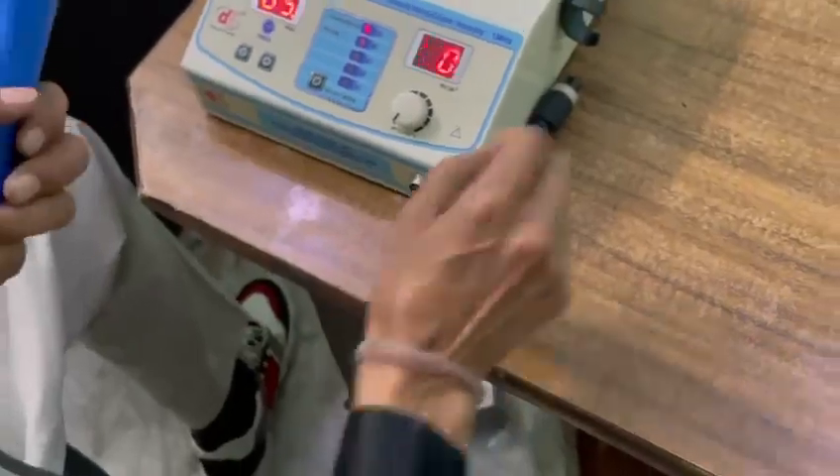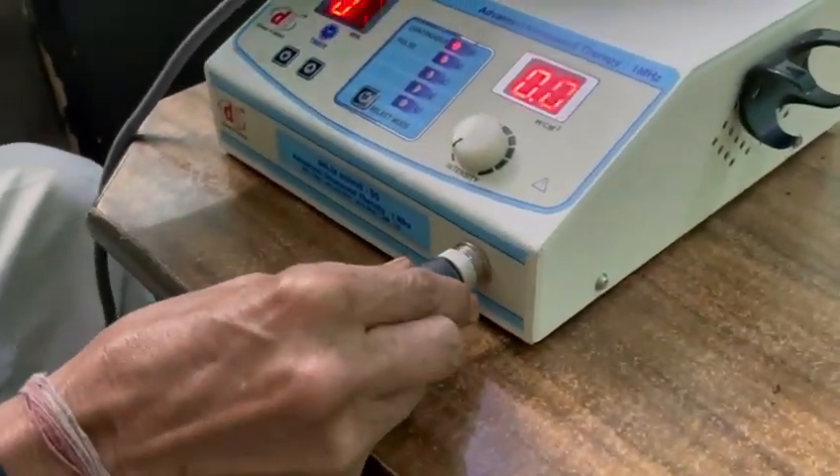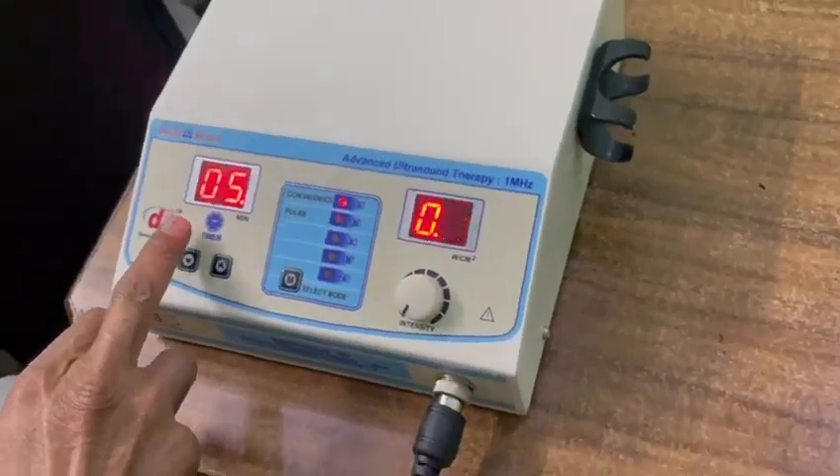Now, connect the ultrasound applicator. We have set 5 minutes.